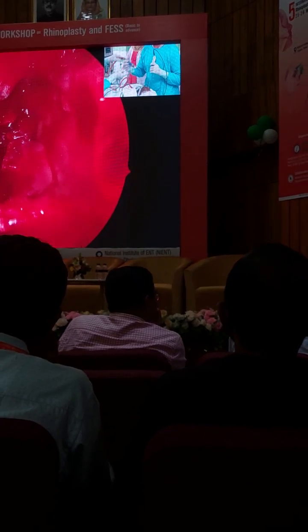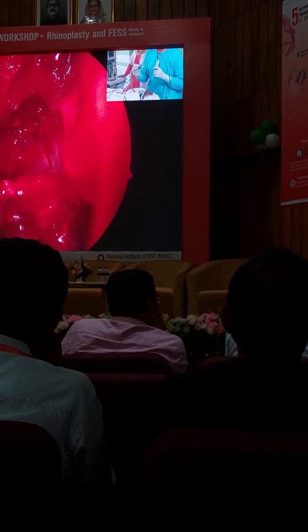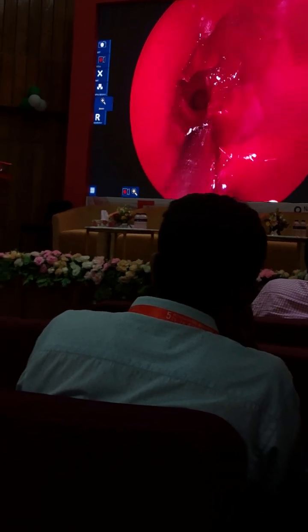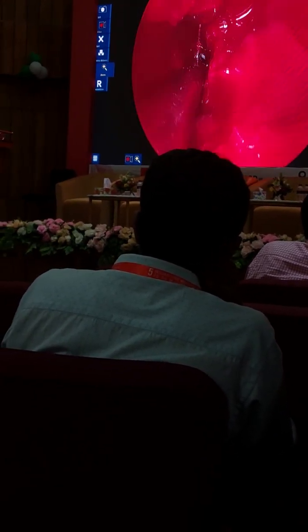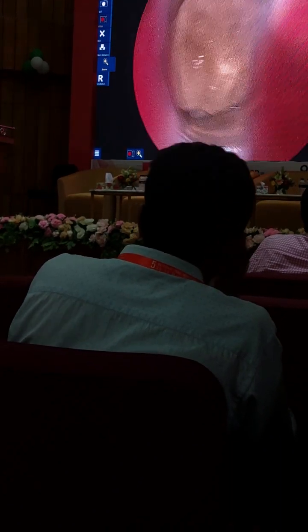Doctor, it doesn't feel good, this is difficult. We do it this way, if he does it this way. In that area, I'm safe. Medial and inferior. So now you see we have a nice wide sphenoid, right? Beautiful. Once we get control of this bleeding, you'll get a better view inside.